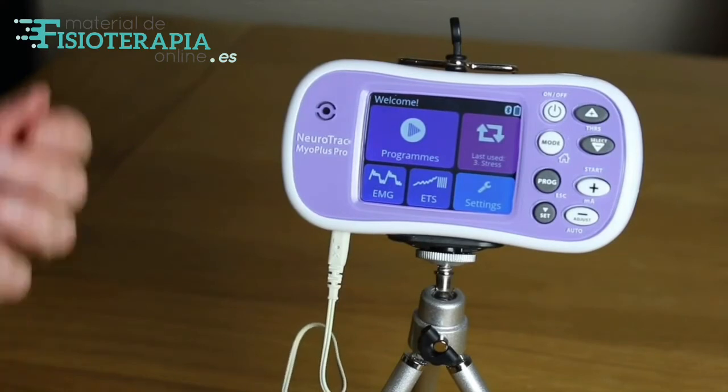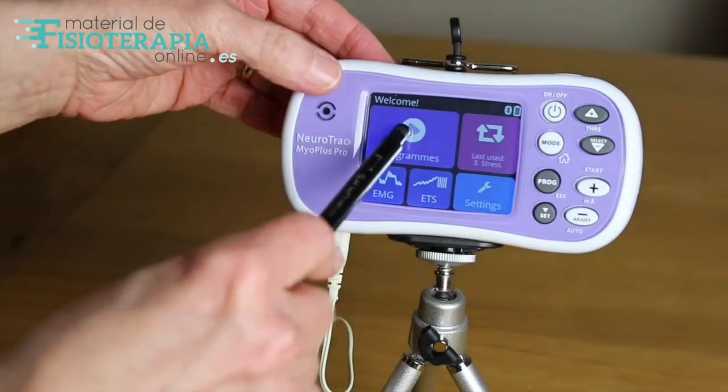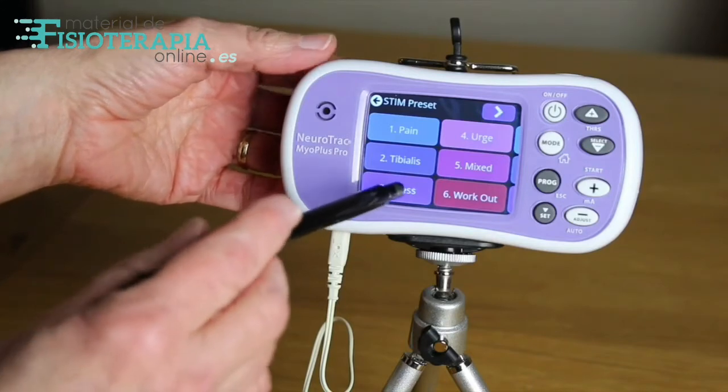Switching the unit on takes you to the welcome screen. Press the program button and you can see some of the various presets for different conditions. Let's focus on preset 3: stress.